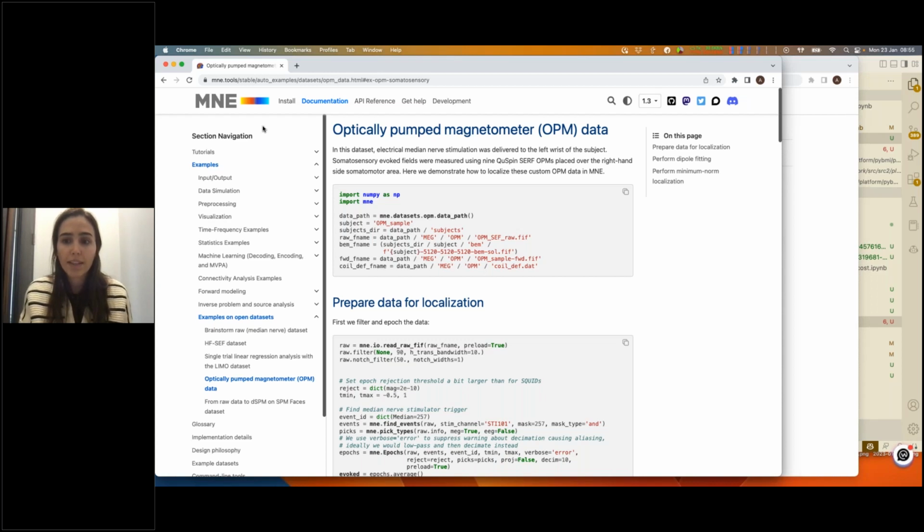Do you have any comment on MEGIN-specific data like rank-reduced data after SSS, whether or not to use gradiometers and magnetometers combined? Thank you. So MNE typically always works with combined MEG magnetometers and gradiometers. MNE has very good support of what we call channel types. So it's completely easy to have in one raw object EEG, MEG, EOG, gradiometers, magnetometers, EMG.